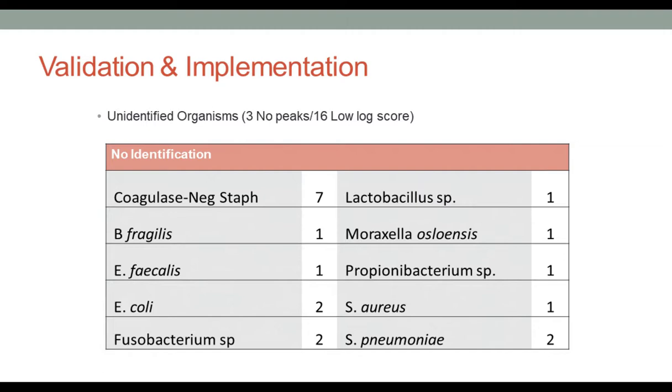and she suggested that when we put our tubes into the microcentrifuge, we make sure that we place them in a certain way. Of course, when you spin down these microcentrifuge tubes, they're at an angle, and so your pellet kind of goes up on the side of the tube. She suggested that whenever you take off your supernatant, you go in with your pipette on the other side of the tube so that you're not disturbing the pellet that's present there. And so we made that minor change, and it had significant impact and improvement in our results.